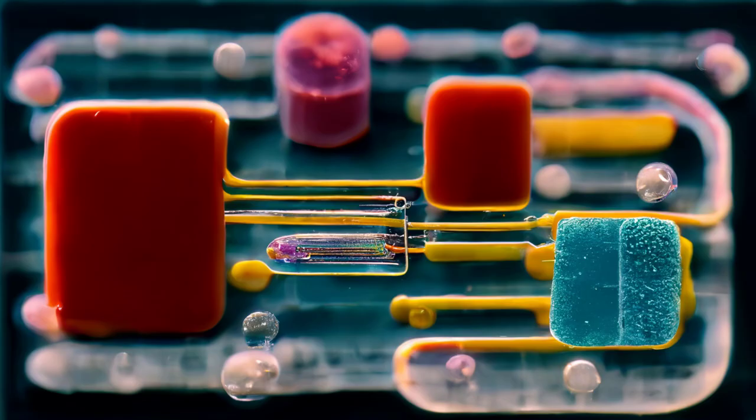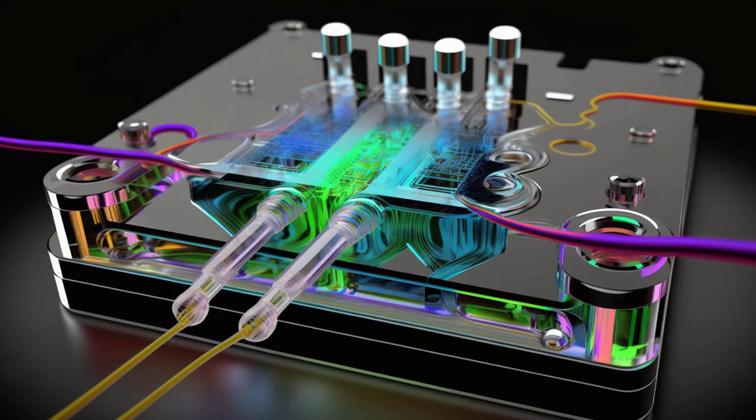What advantages do microfluidic techniques offer for microbubble synthesis? Microfluidic synthesis uses tiny channels on a microchip to precisely control the mixing of liquids and gases, resulting in microbubbles with very uniform sizes and properties. In a microfluidic device, the flow of a lipid solution and gas is carefully regulated, ensuring that each microbubble is nearly identical. A common question is, why is uniformity important?